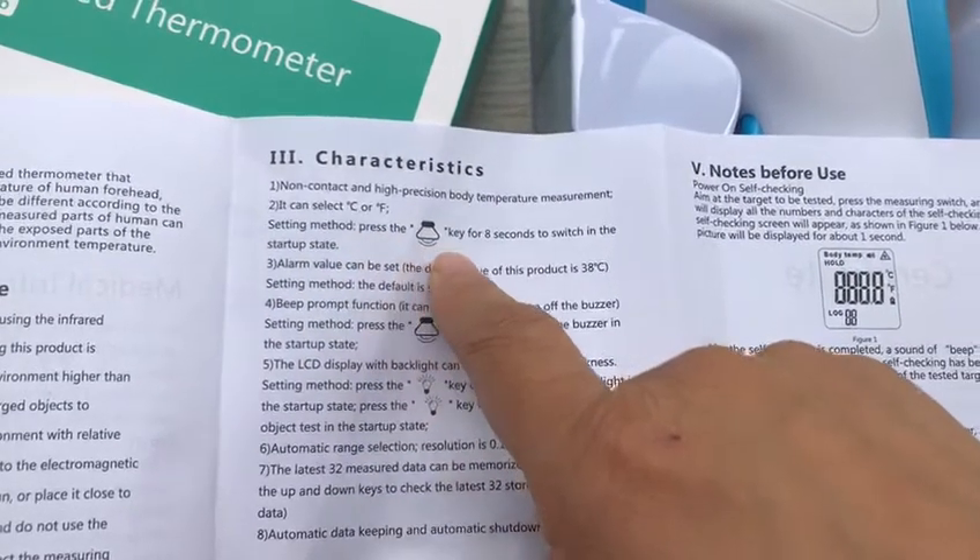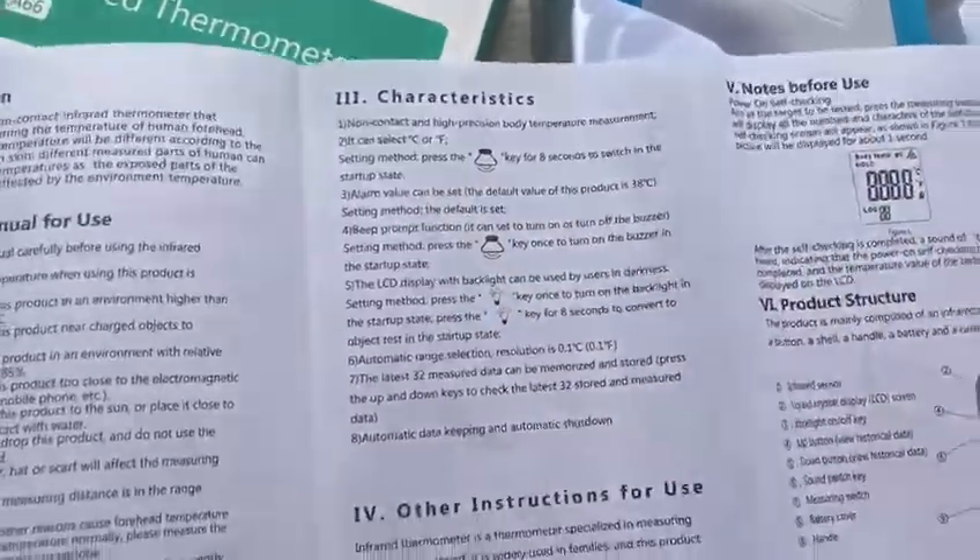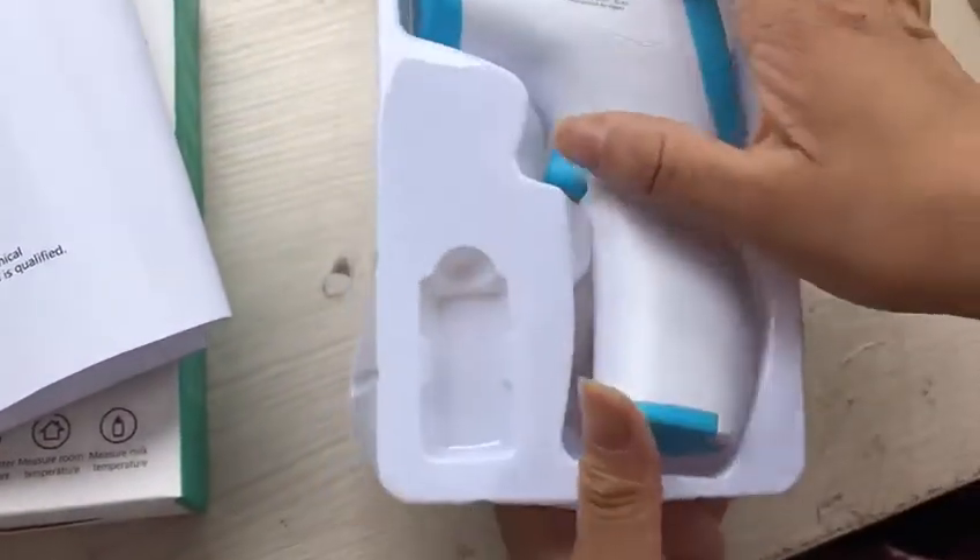Now we press the key for eight seconds. Okay, we will show you. This is our product.